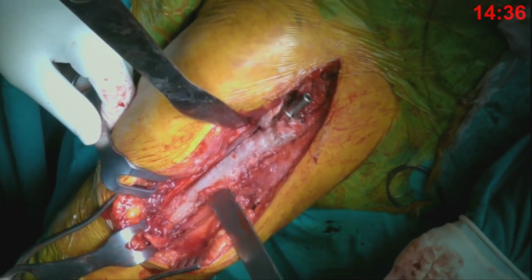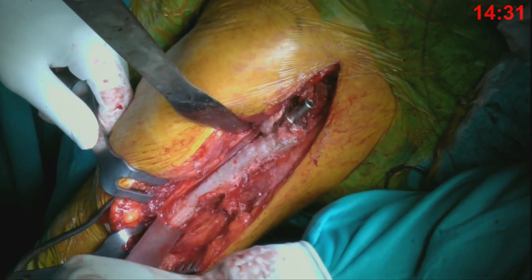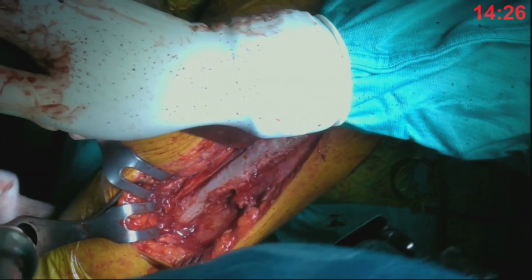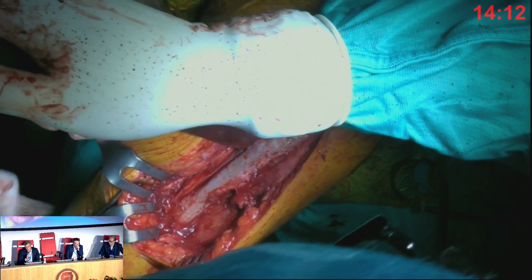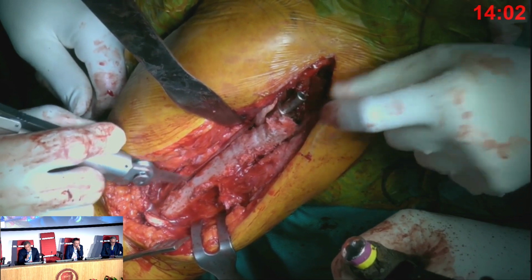And then we switch to a window. Do you agree with this algorithm, or do you have some other option before doing such a large window? Yeah, I think on the preoperative X-rays, the stem looked well fixed. So I guess our approach is to use curved osteotomes and K-wires from the top and remove the metaphyseal bone around the stem, and then we work in a stepwise fashion, creating a linear osteotomy and then extending that to an L if required.